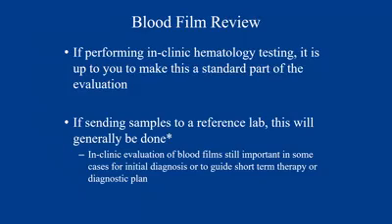If you're sending a sample out to a reference lab, generally they're going to look at the blood film. There are some exceptions where you can select just for automated data only for a cheaper panel, but then be aware that that data is not being corroborated with a blood film review because you're not paying for that service. So just be aware. And even if you are sending out blood, take a minute, make a blood film before you send the blood out, because that may give you clinically relevant diagnostic information that's going to change how you treat this patient, and potentially may save its life and save the owner a lot of headache and a lot of money.